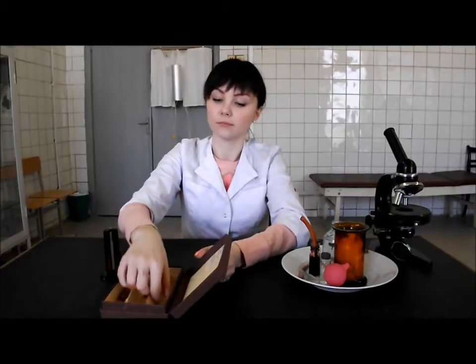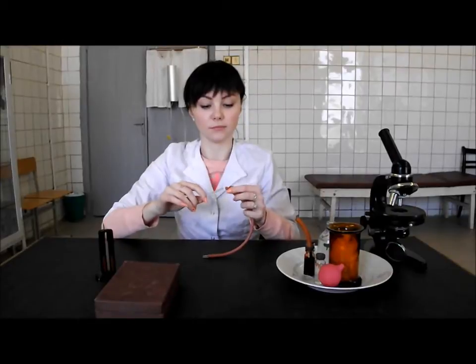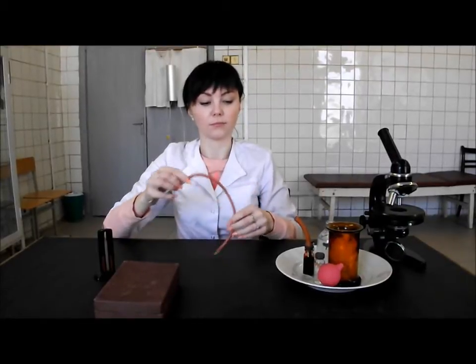Take the capillary with the mark 0.02 ml from the box. Connect it with the rubber tube and fix the spray bulb with the tube.